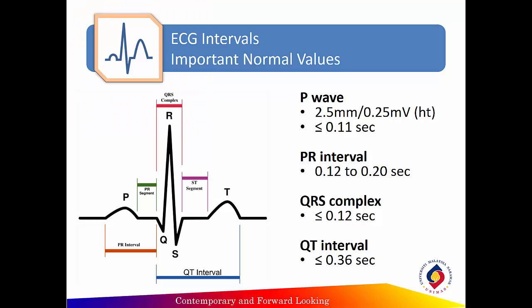This is a summary of the important normal ECG intervals which we have just covered. With these basics in mind, you are now ready to move into analyzing and interpreting ECG rhythms.